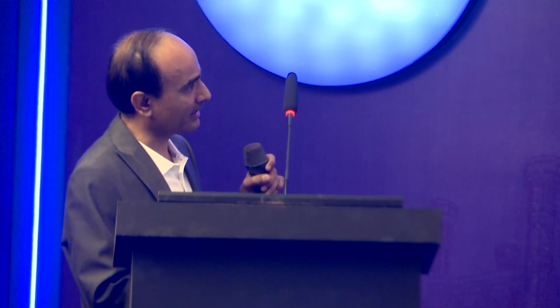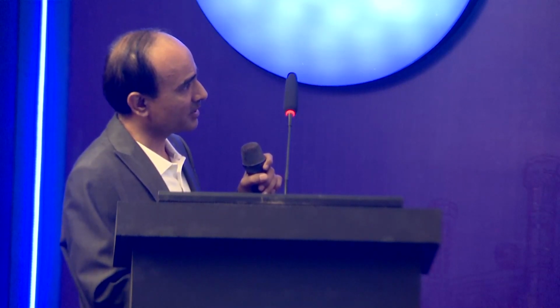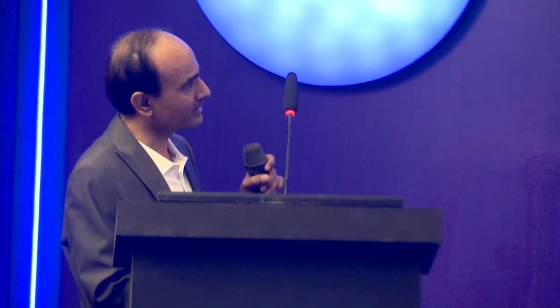Second, we wanted to place a parallel wire. You can see a parallel wire coming in so that we can have a good safety wire over there, and then we can do something with the other wire and the balloon. Because 1 or 2 struts were hanging beyond the ostium of the left main, the wire kept either getting entangled with this balloon, or when we pulled the guide back and tried to reorient it, it kept going behind the stent struts. So it was not going luminal, it was actually going abluminal.